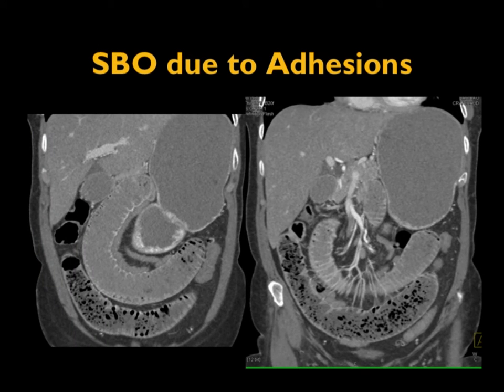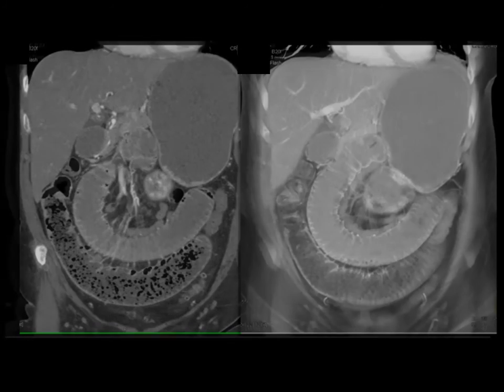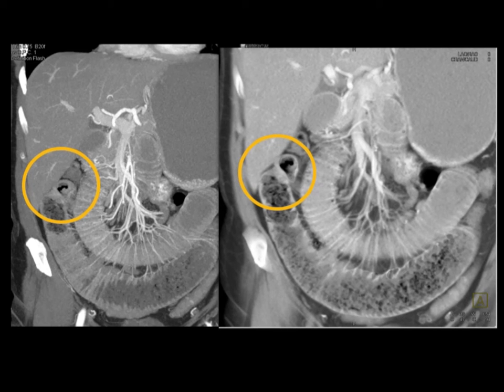In this case, you see the dilated bowel and the feces sign — that large loop looks like it has feces. Following the bowel to the right upper quadrant, you can see a transition point there. With volume rendering and MIP you can see and circle the transition point. There's no mass — that's a classic appearance of adhesions. This patient had an appendectomy 20 years earlier, and when the surgeon went in, all they found was one adhesion coming across. All you need is one adhesion. Laparoscopic surgery does not mean no adhesions, and with multiple trocars we may see more adhesions in the future.